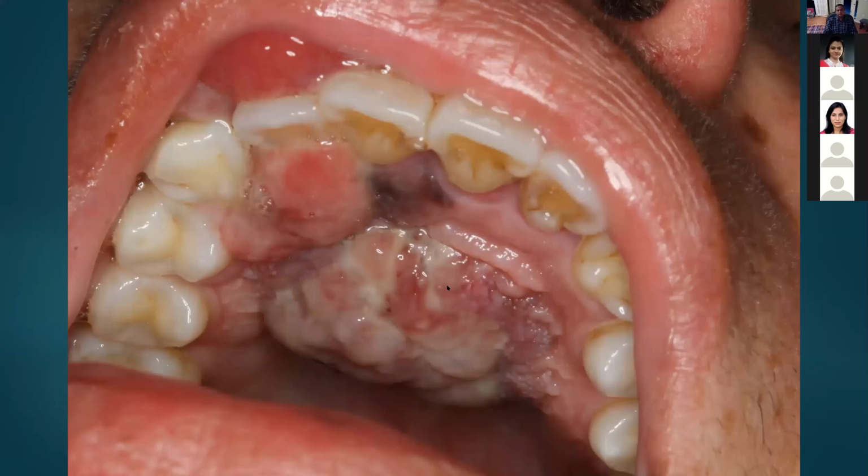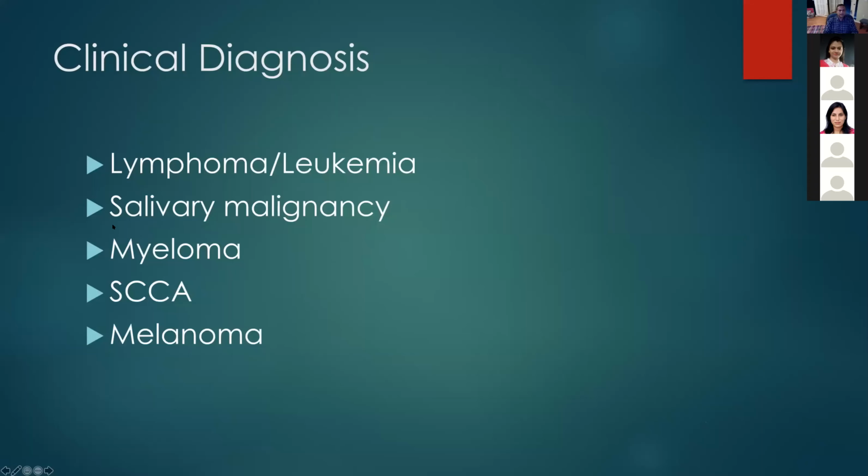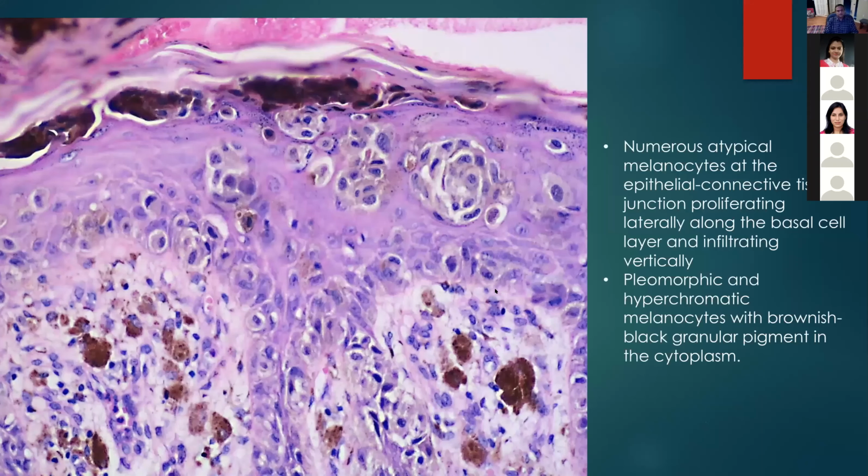Okay, and this is the initial biopsy. You can see numerous atypical melanocytes. And I'm not going to give you a lesson in diagnosing melanoma. If you have seen one, it is frightening to look at. As soon as you put the slide in, the difficult ones are the very subtle melanomas. This is clearly evident with these kind of melanocytes going up in the epithelium. It's almost a given diagnosis. It's not a very difficult diagnosis.